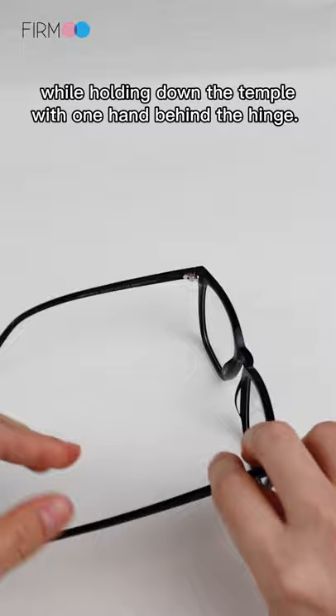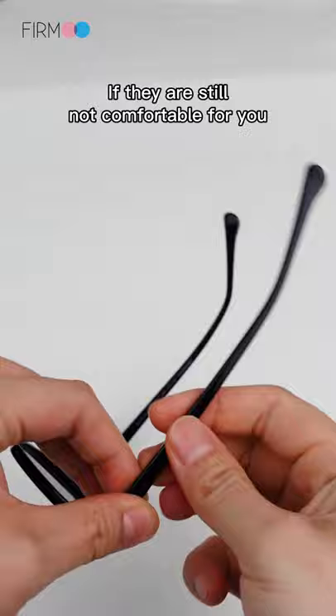After the two temples have been adjusted slightly, try them on. If they're still not comfortable, repeat the previous steps until the adjustment is appropriate.